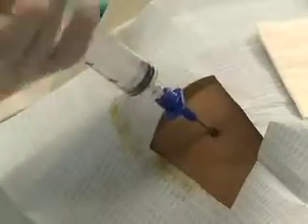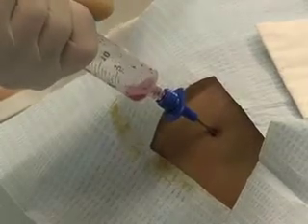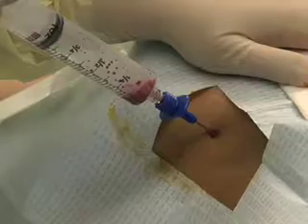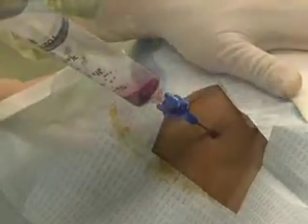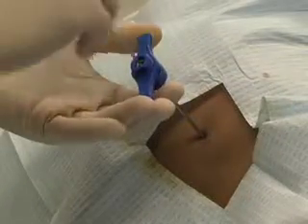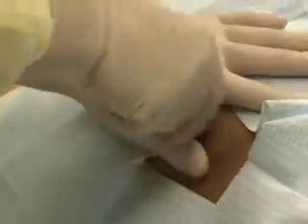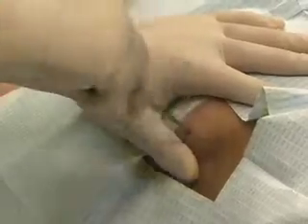A bone marrow aspirate and biopsy are useful tools in assessing a variety of hematologic, oncologic, and other disease processes that may involve the marrow space. Attention to detail and care for the patient can yield valuable information that is not available by routine blood studies.